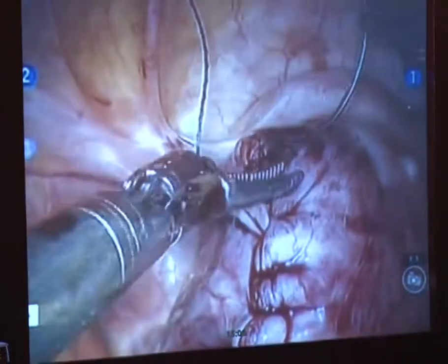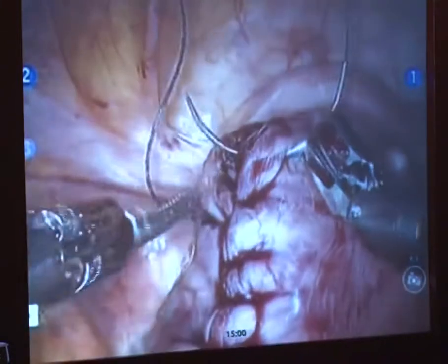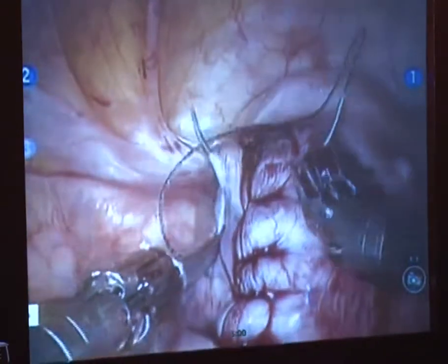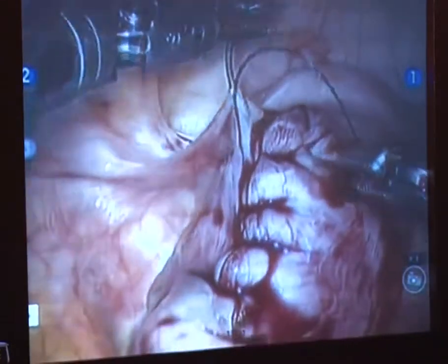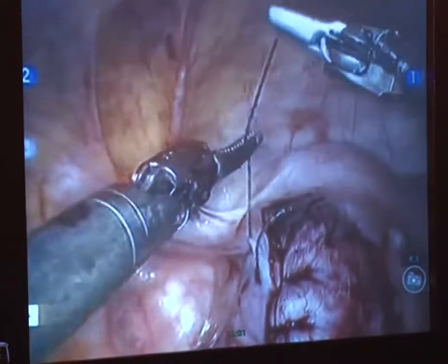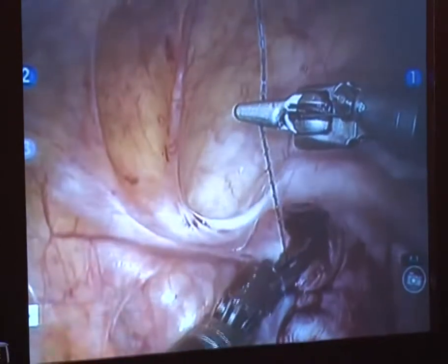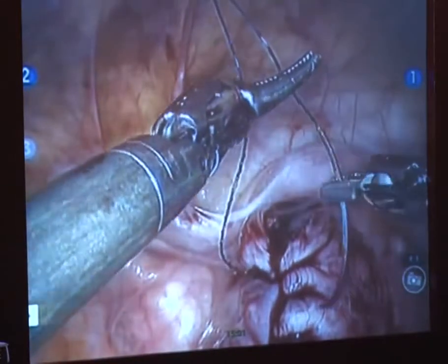Oh, well, actually, I didn't think we'd be able to do it, but we may get away with one suture for a two-layer closure here, which is surprising, because I thought the defect was a little bit bigger than that, but I guess not as much as I thought. And then once we get this closed, we'll address that fibroid in the broad ligament.